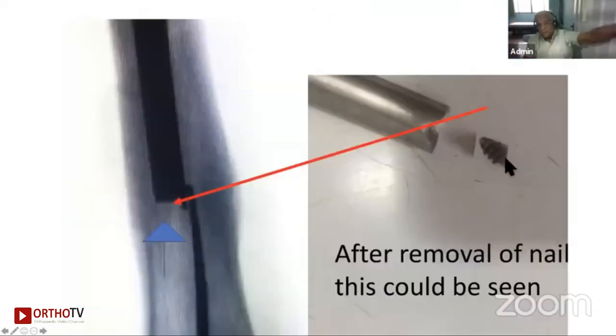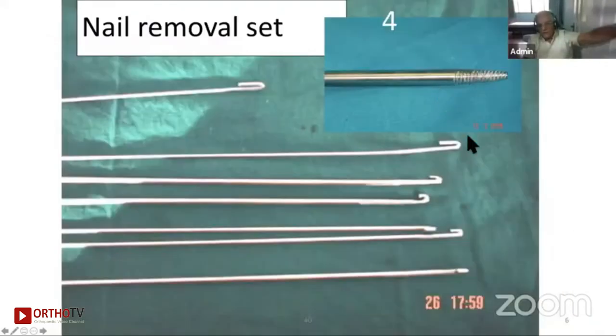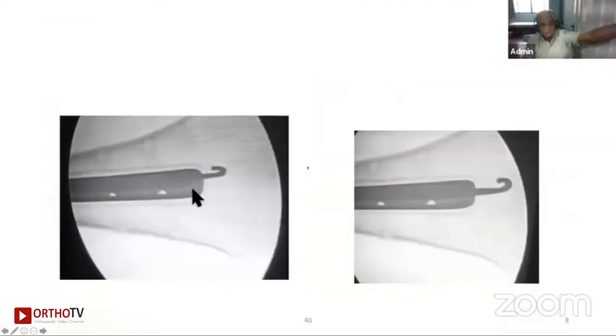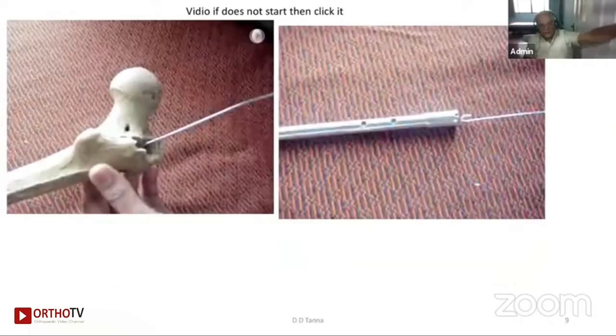Now here is the one where I used this instrument, and it broke down at the end. So once it breaks down in the end, here is the hooked wire which goes in, and it is the one which will be able to do the same thing. You'll be able to take it out. Here, as you can see, the hooked K wire is going in, and it will take out the same implant. It is much easier.